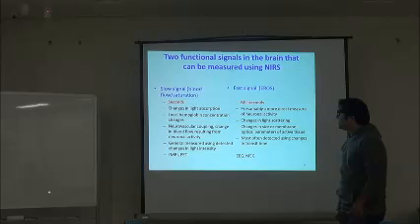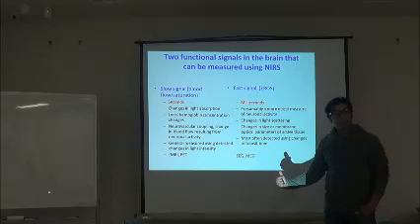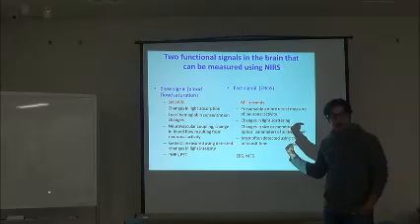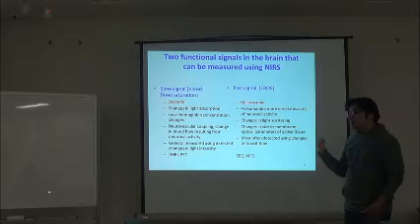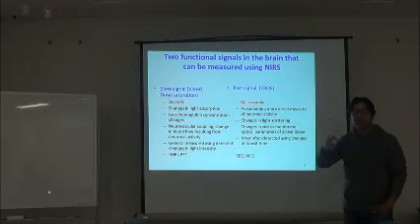Well, how is it produced? In the case of the fast signal, we do not measure the changes in oxygenation of the hemoglobin, but we measure the changes in the light scattering because of neuronal firing. When the neuron fires, there are some changes in the membrane of the neuronal ensembles.